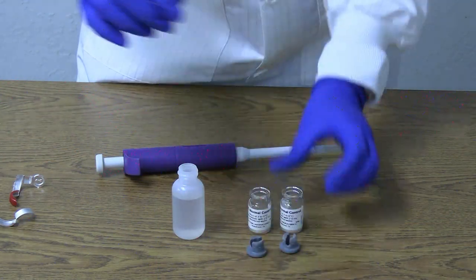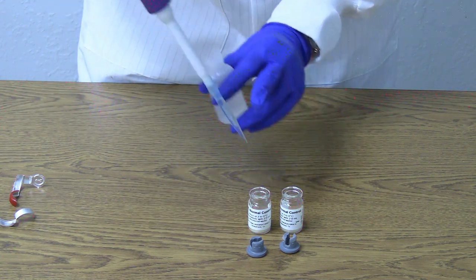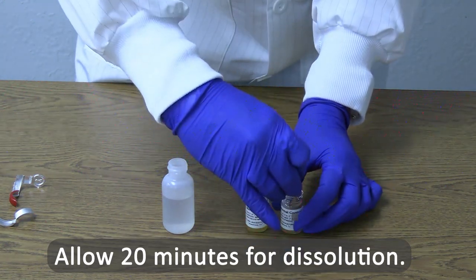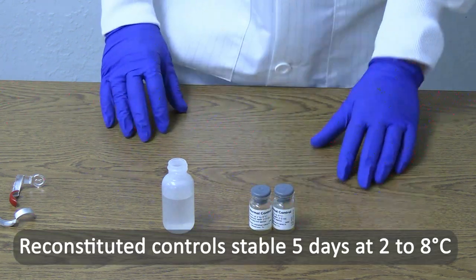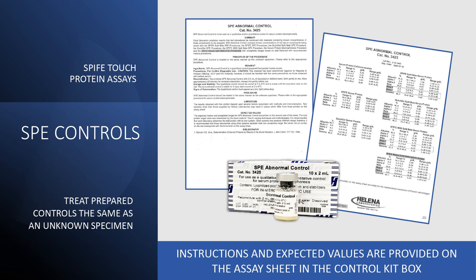To prepare these lyophilized controls, simply reconstitute them with 2 milliliters of deionized or distilled water. After adding the water, gently swirl the vials to ensure thorough mixing and allow them to sit for approximately 20 minutes to completely dissolve. Once reconstituted, these controls remain stable for up to 5 days when stored at temperatures between 2 to 8 degrees Celsius. It's essential to treat the prepared controls in the same way you would an unknown specimen. You will find comprehensive instructions, expected values, and details about the total protein content of the reconstituted controls in the assay sheet provided within the control kit box.